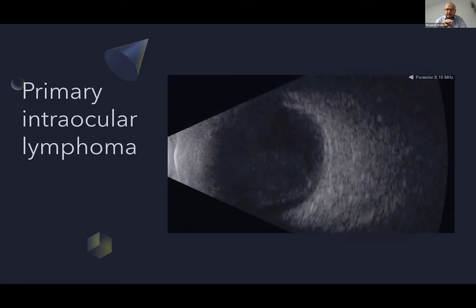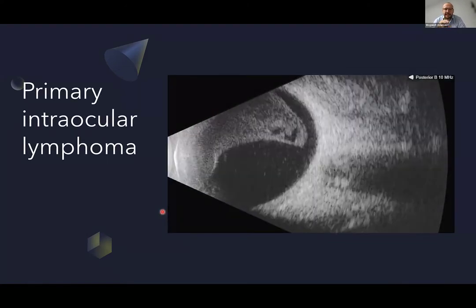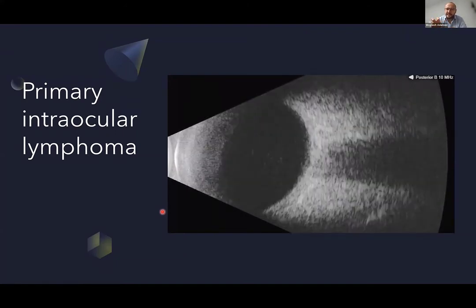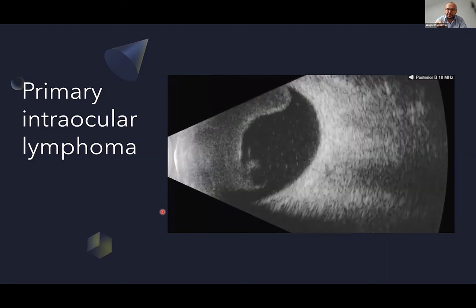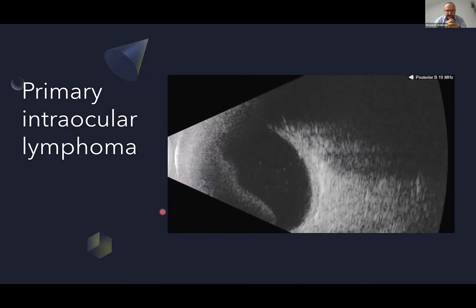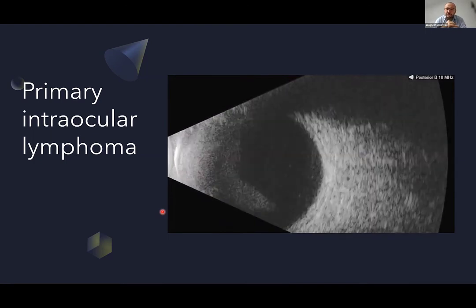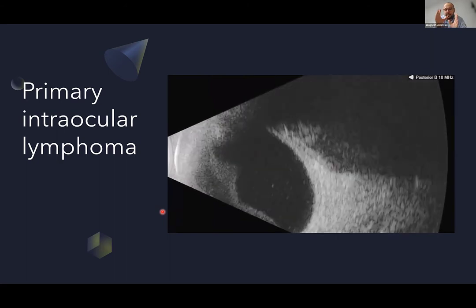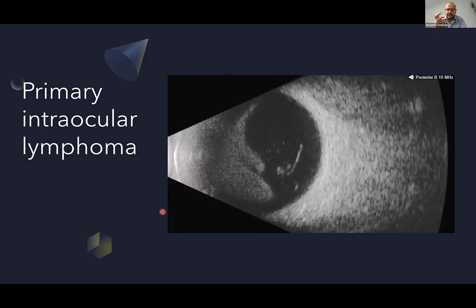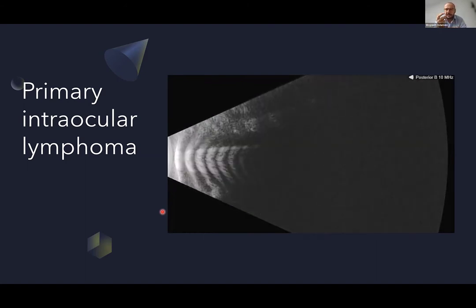And closing to the end, I'd like to stress that not all floaters, not all opacities in the vitreous are associated with blood or inflammatory process. And sometimes what we see are patients with primary intraocular lymphomas. And I don't know if you can see, again, this movie playing smoothly, but this vitreous in primary intraocular lymphoma behaves very lazy.